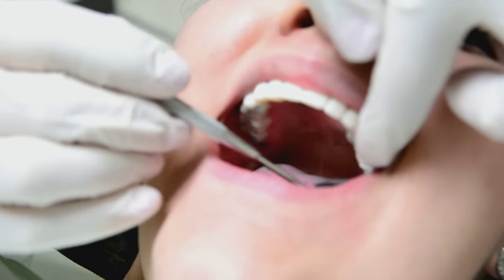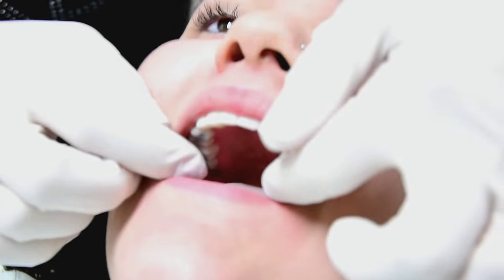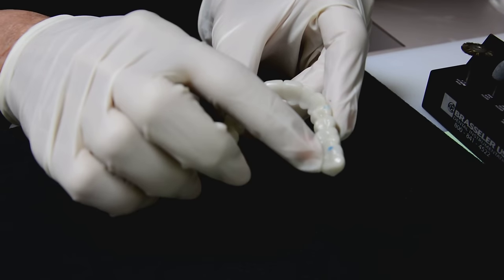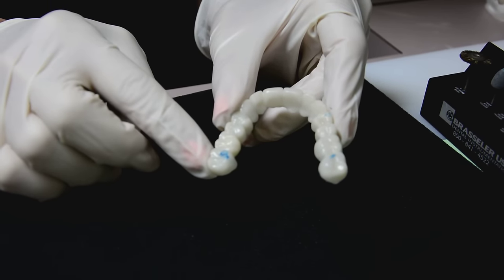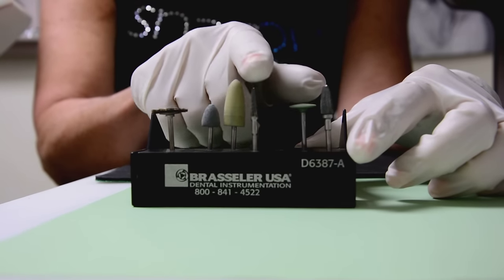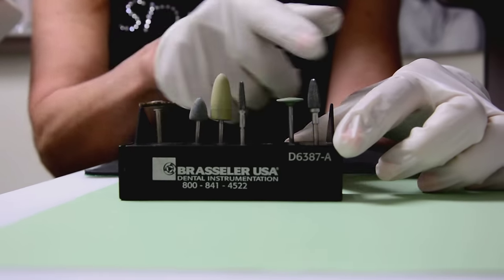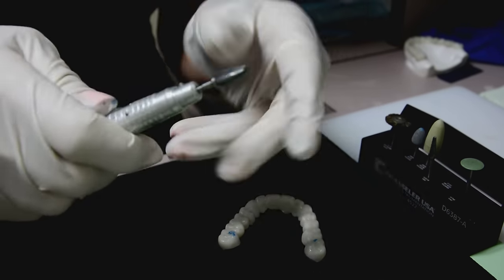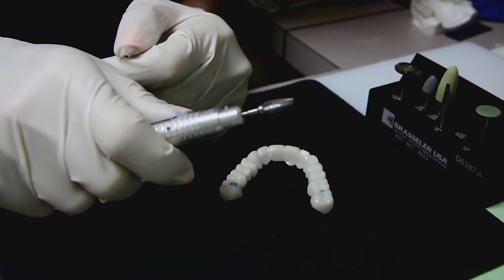First, ask your patient: when you bite down, does it feel even or are you hitting on one side more than the other? It feels even, and it looks even too. You can see the marks are pretty even on both sides, though she might be a little bit heavy in one area. So I'm going to use the snap-on smile bur kit and place it into my handpiece to adjust.